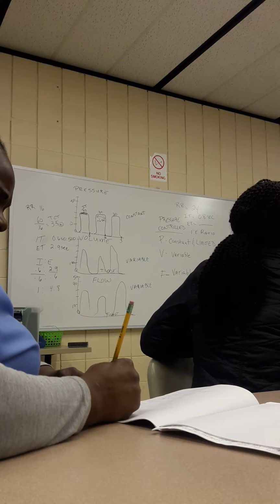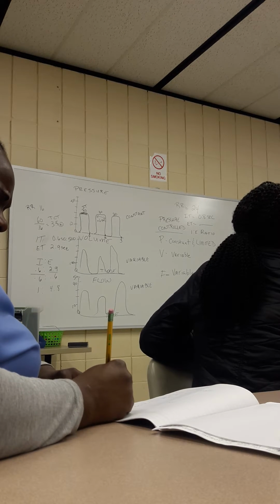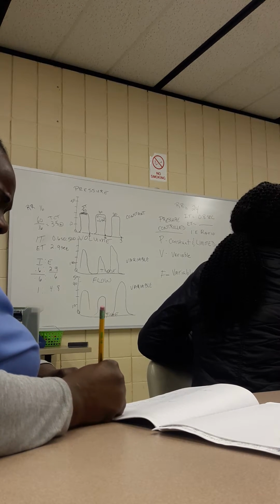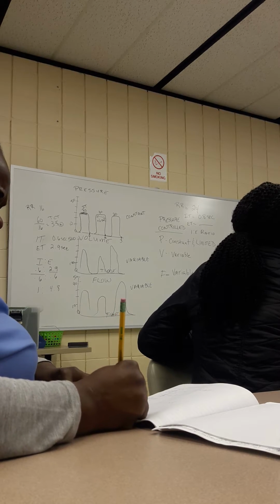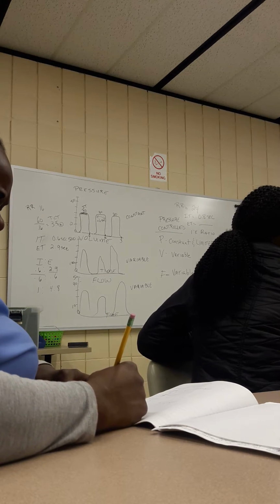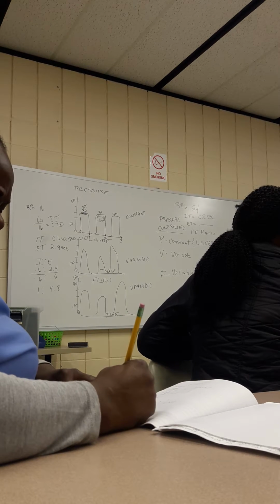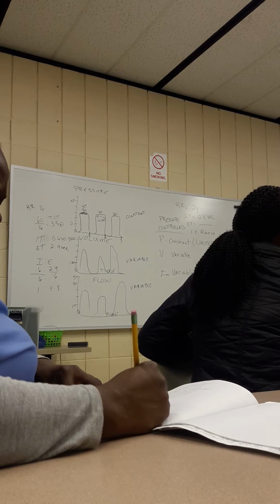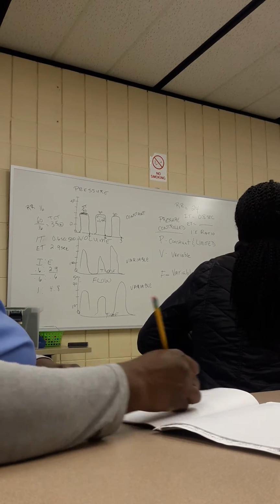What they will do is throw in distractors, like if you didn't move your decimal point, or if you were supposed to use the plateau and you used your PIP, they would put an answer in that corresponds to that, but not off by a point. It won't be like 4.8, 4.6 in the answers. We pick the one that's closest to what we get. Correct.